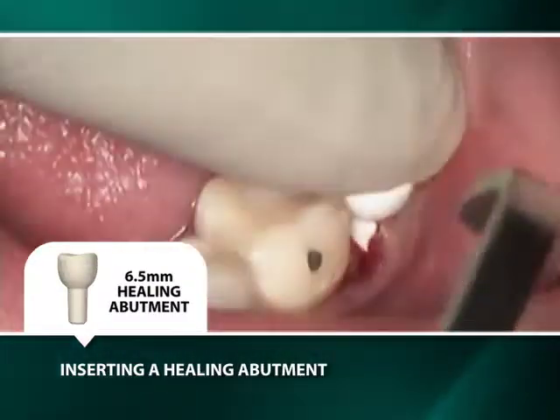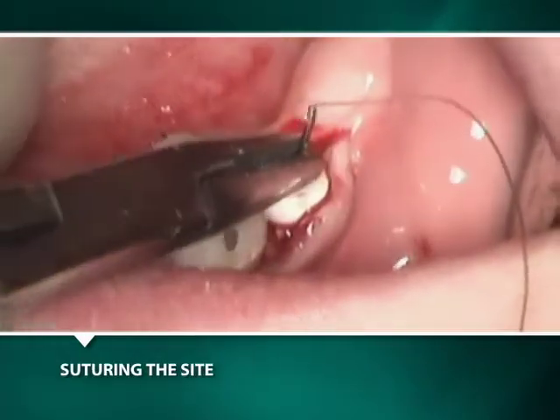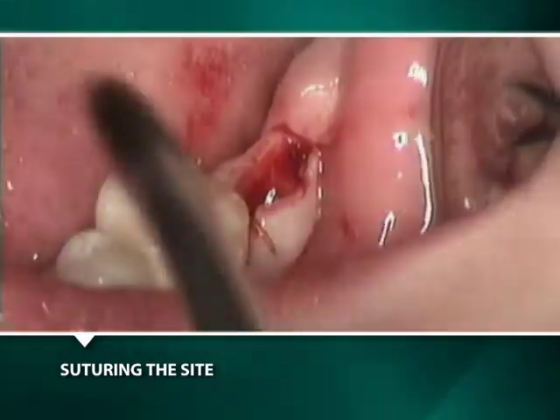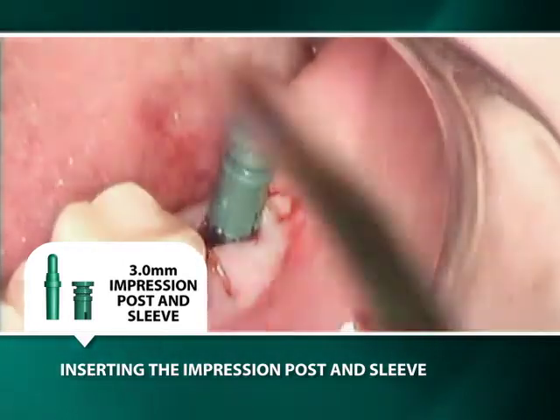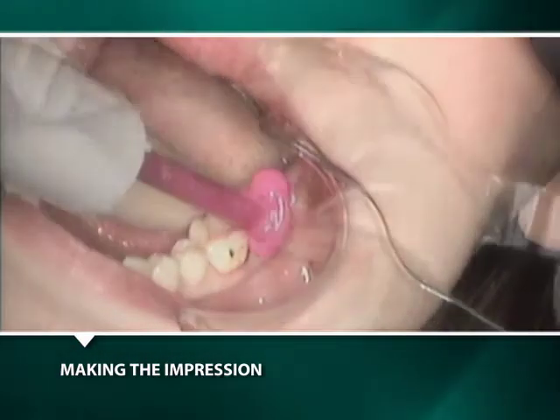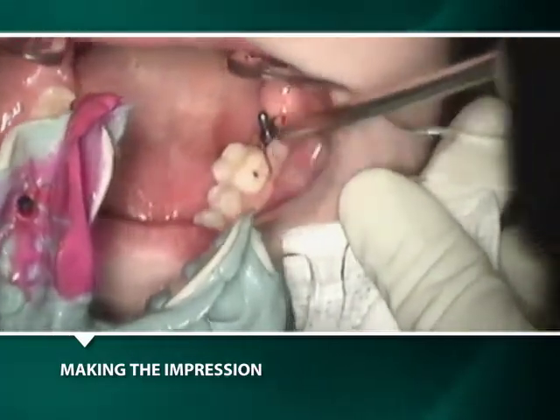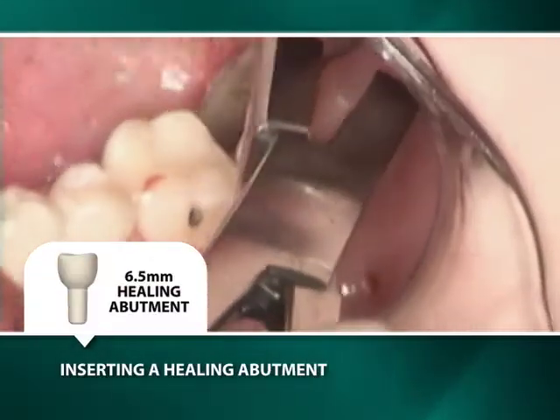A white healing abutment is inserted into the implant with finger pressure to help contour the tissues prior to their being sutured. The white healing abutment is easily removed for the making of an implant-level transfer impression by inserting a green 3 mm titanium impression post in its corresponding sleeve with only finger pressure into the well of the implant. Purple impression material is injected around the impression post and sleeve, and after two and a half minutes the impression is removed containing only the green acrylic sleeve. To assure accuracy of the transfer impression, it is essential that the green titanium impression post remains in the well of the implant. The green titanium impression post is then removed for the insertion of the white healing abutment.